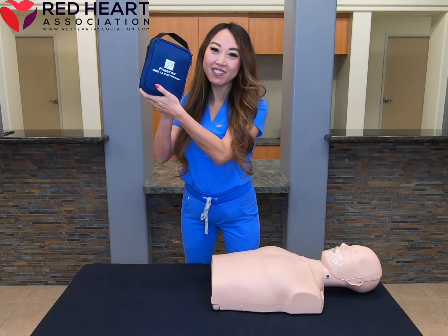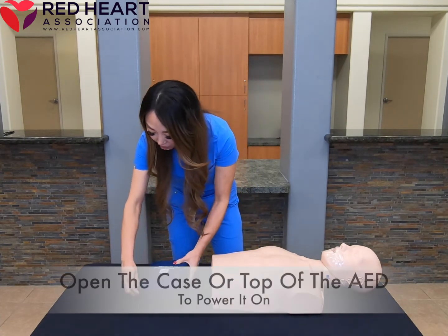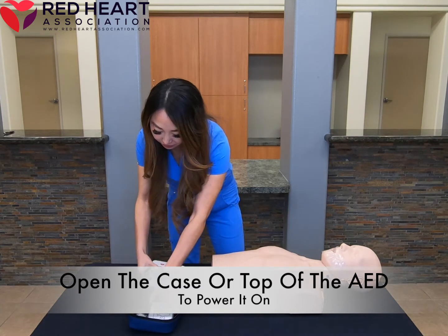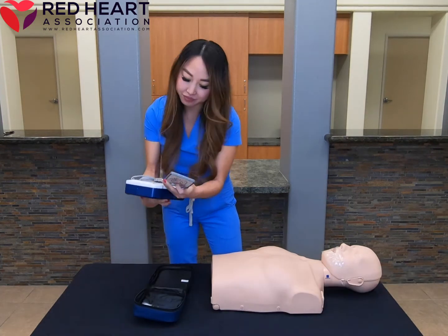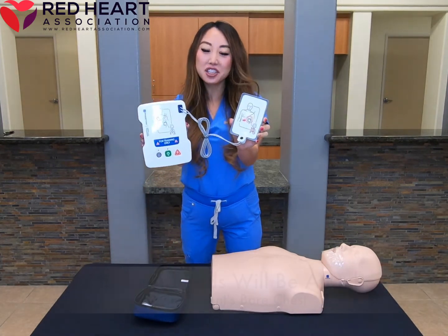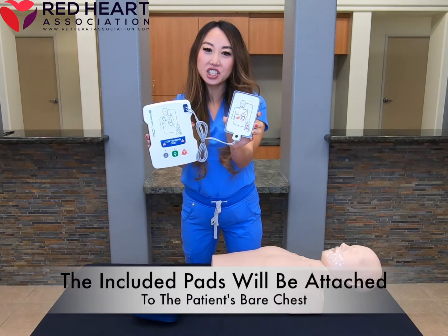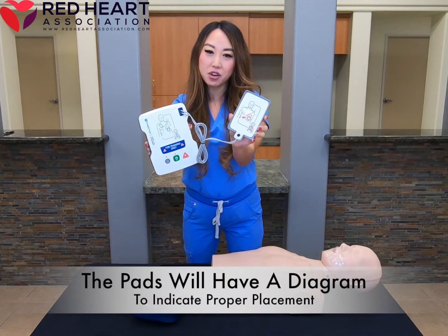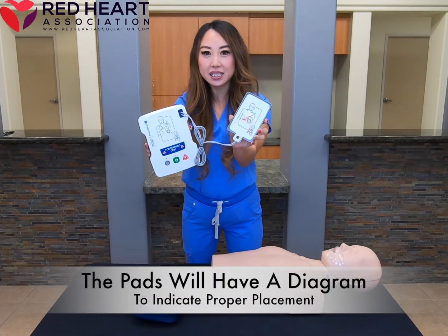You have just received the AED. To power on, open the case or the top of the AED. The included pads will be attached to the patient's bare chest. The pads will have a diagram to indicate proper placement.